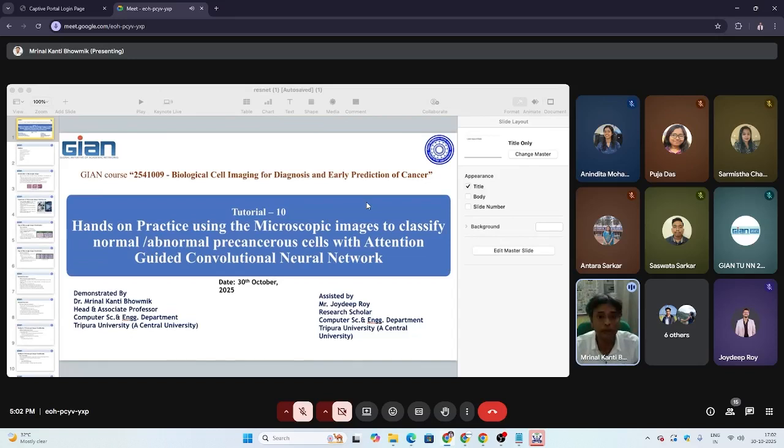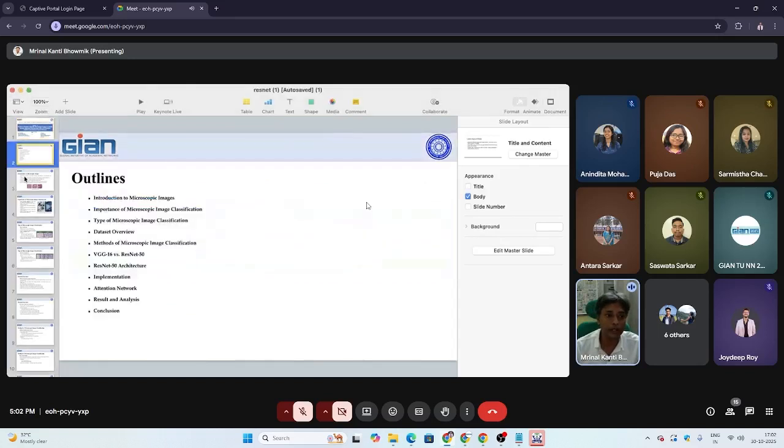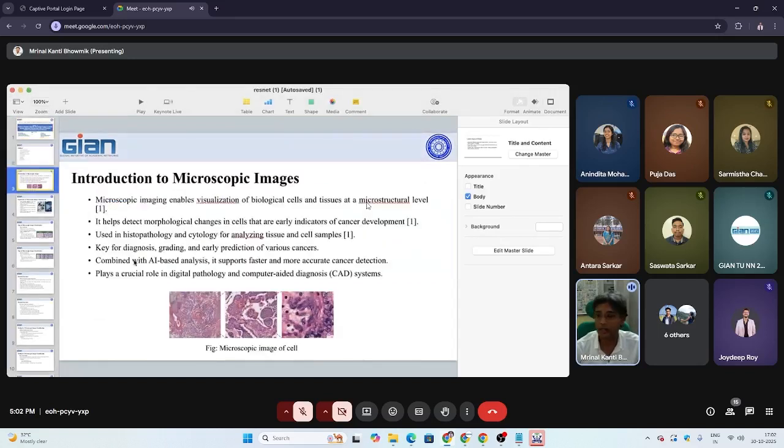So I think you will do some, that is ResNet, I think. Joydeep, ResNet, na? Yes, sir.